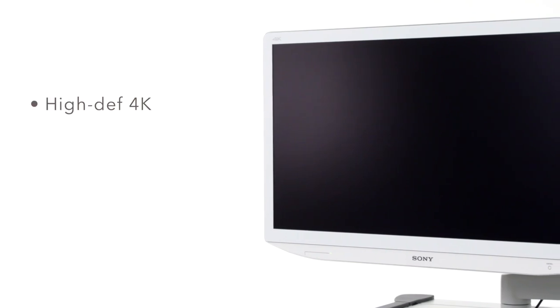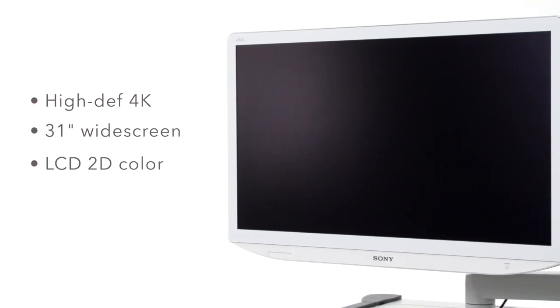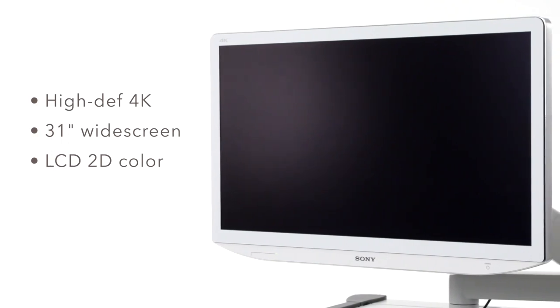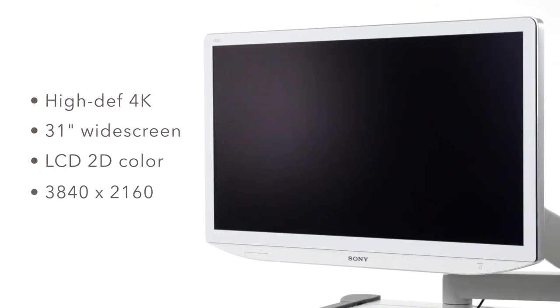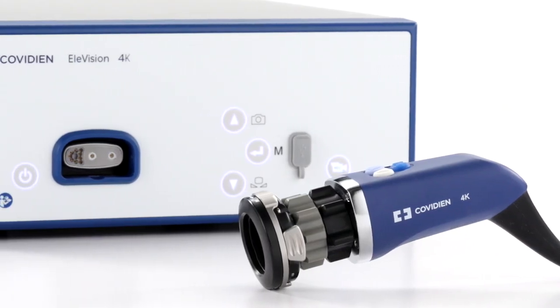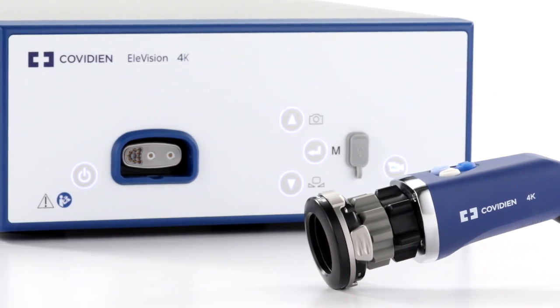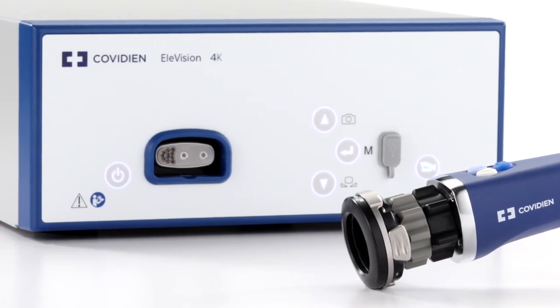The Elevision medical grade monitor has a high definition 4K 31-inch widescreen LCD 2D color screen with a resolution of 3840 by 2160. The camera system offers a 16 by 9 4K image using progressive scanning at 3840 by 2160.